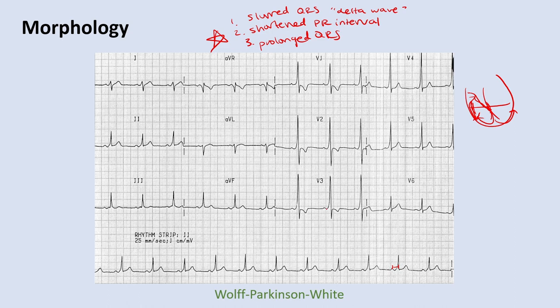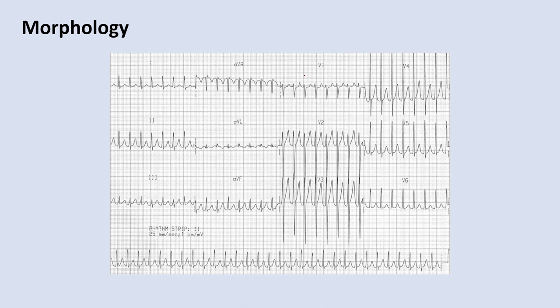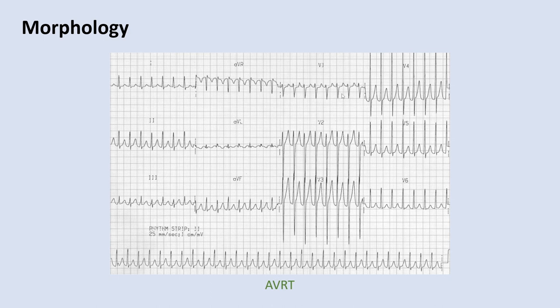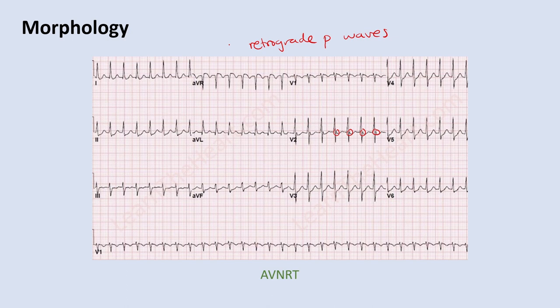This is AVRT — a supraventricular tachycardia with a narrow complex and a heart rate of about 150 (300 divided by 2 big boxes). Compare this to AVNRT: also about 150 bpm with a narrow complex, but in AVNRT you can see retrograde P waves — little upstrokes right after the QRS complex. The key finding: a regular narrow complex tachycardia with retrograde P waves should make you think about AVNRT.